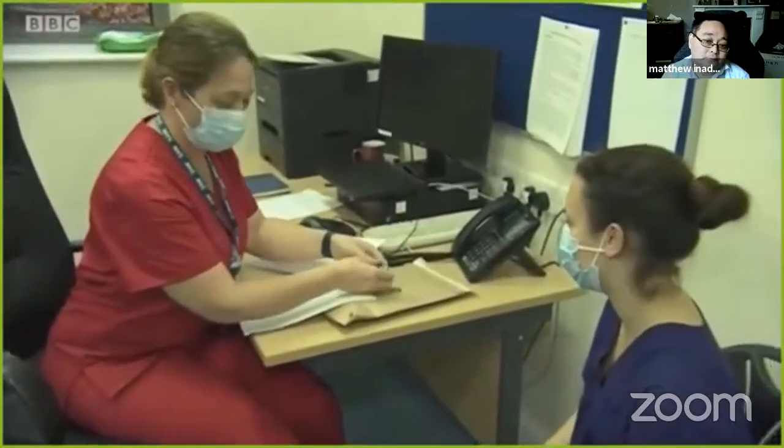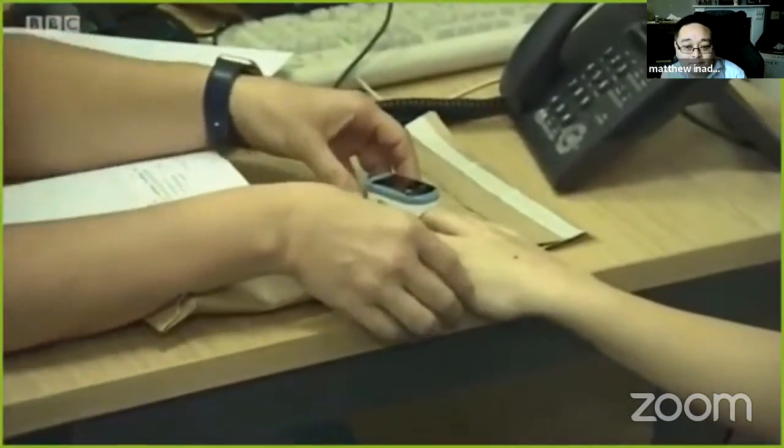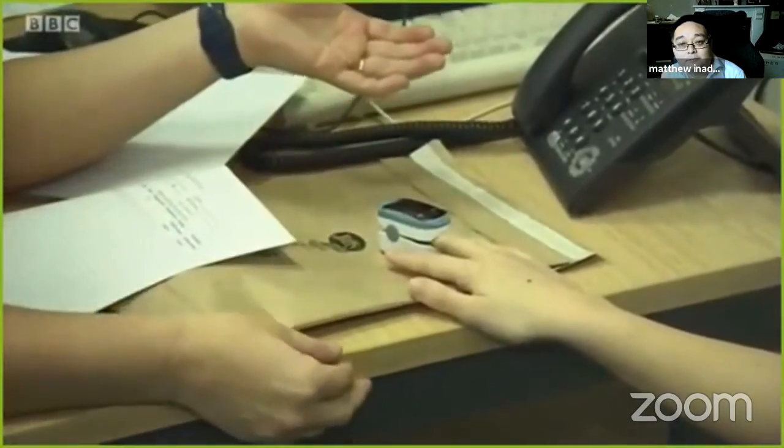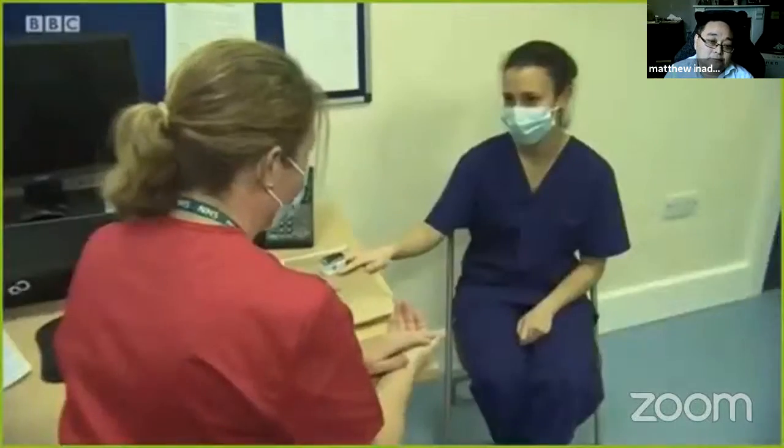The device is being used as it was noticed during the first wave of COVID that some patients were experiencing a drop in oxygen levels with no obvious symptoms. If we wait until they have symptoms before they go into hospital, their risk of ending up on intensive care is significantly higher. So the sooner we can admit people to hospital and get them on the good treatments we now have, the greater chance they have of getting home and getting home sooner.